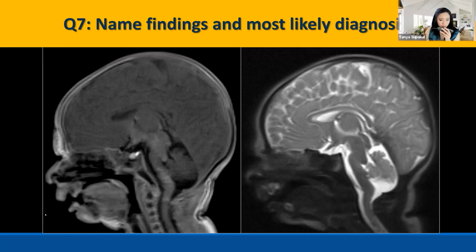Number 7, who do we have here? We have 2 more questions. Question 7, who wants to take this one? Name the findings and most likely diagnosis. Wes, can you take this one from me, please? Sure.